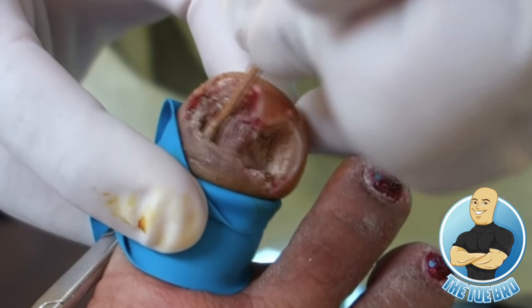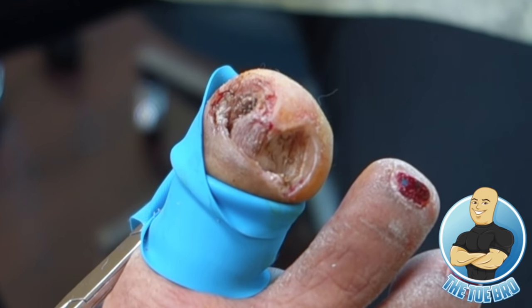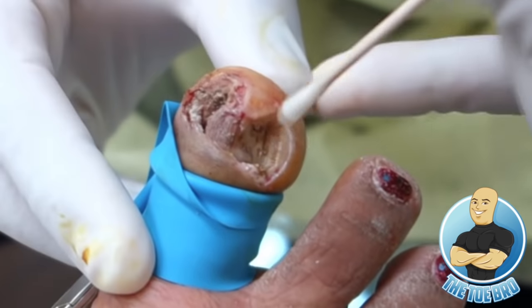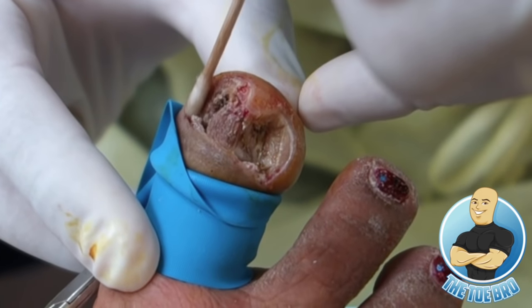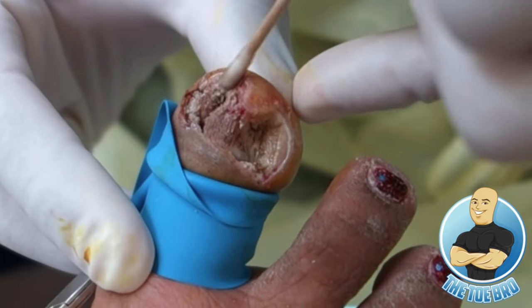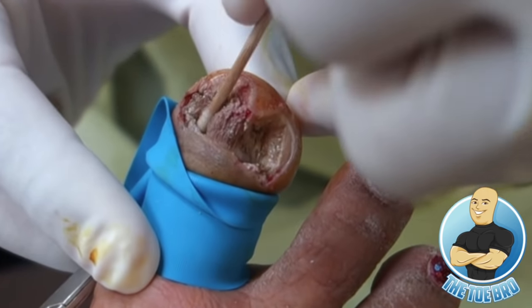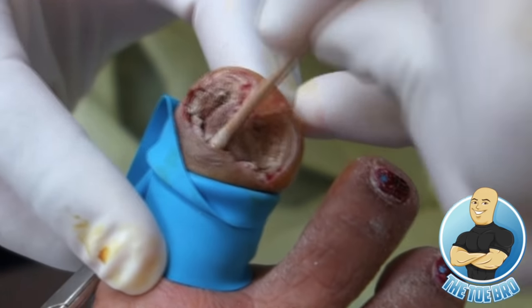It wasn't so bad, was it, Tita? No, it's not. Hardest was the needle, right? Mm-hmm. I don't know after. We'll see, but again, the freezing's gonna last 10, sometimes 12 hours. Okay, so you're gonna give me a pain reliever or what? No, just extra strength Tylenol. Okay.